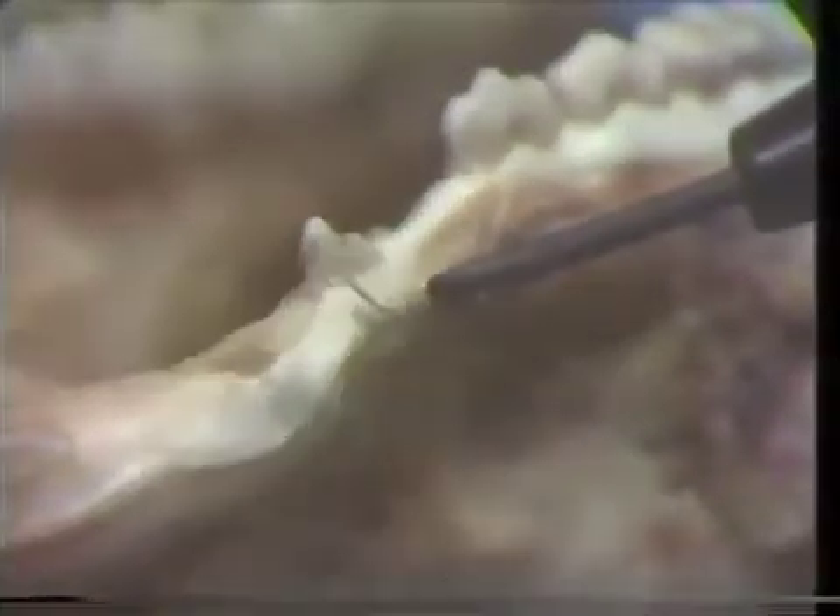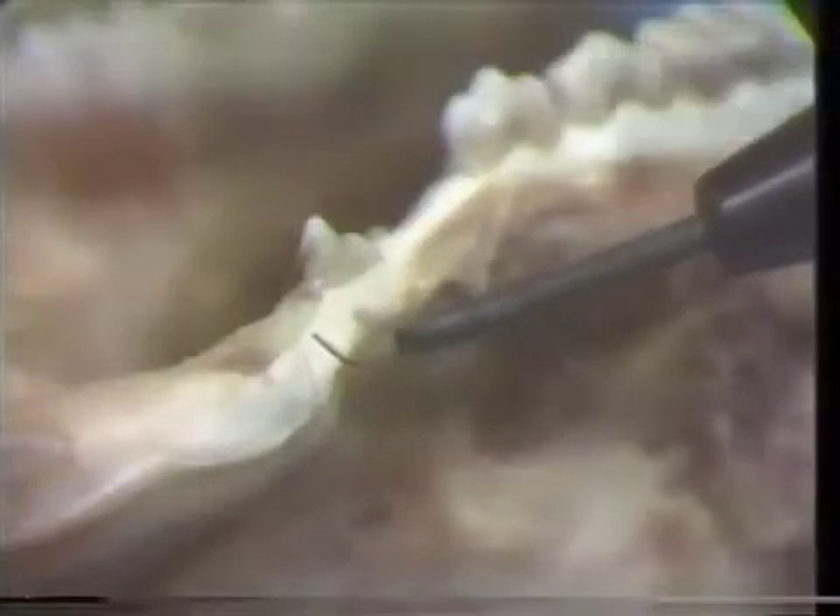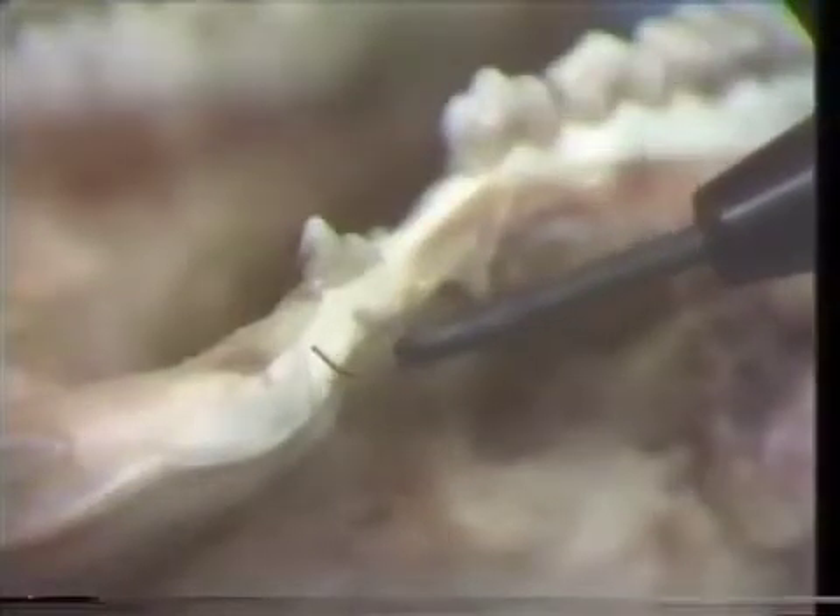I'm now going to calibrate this needle electrode, and I'm going to start with too much power and make a cut on this epithelial tissue.